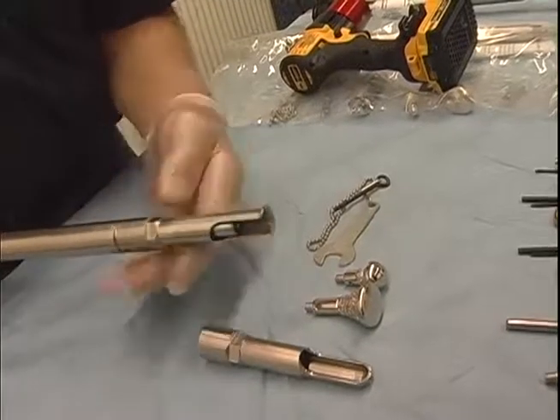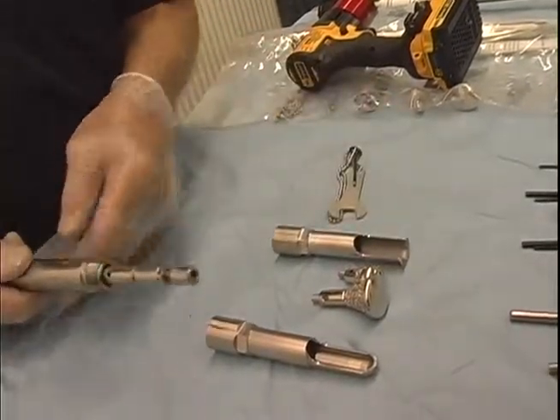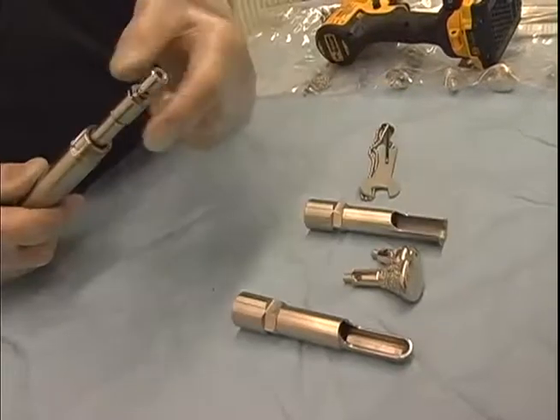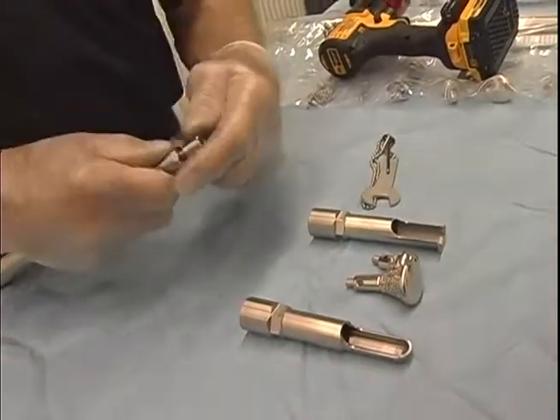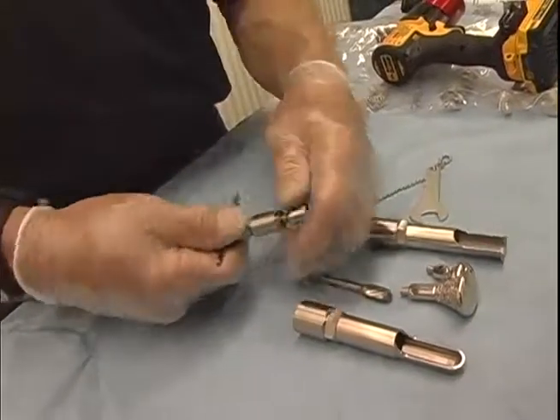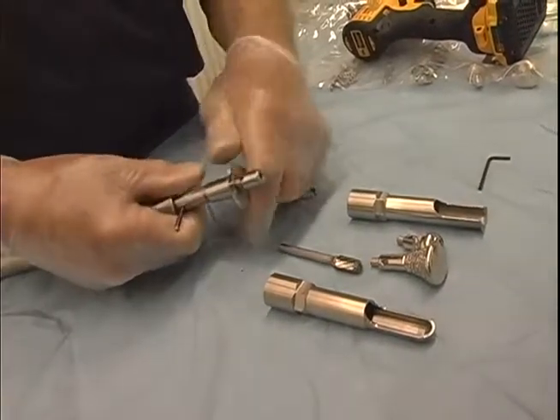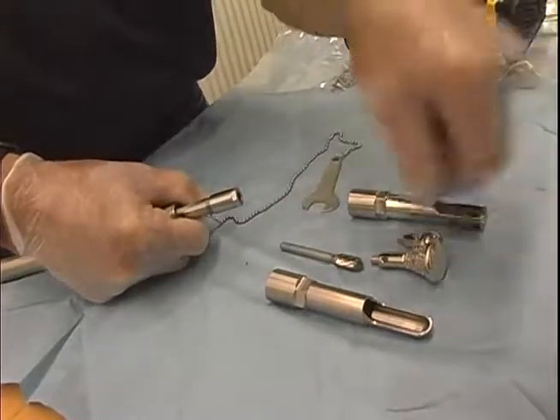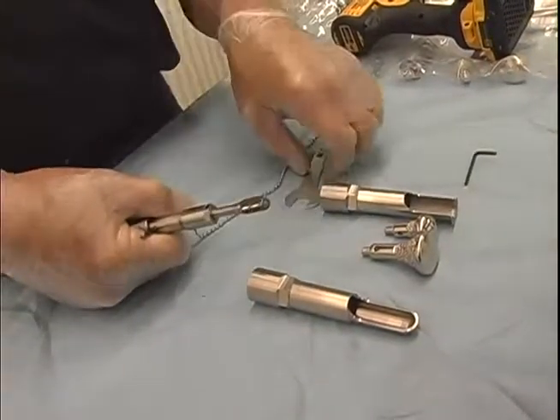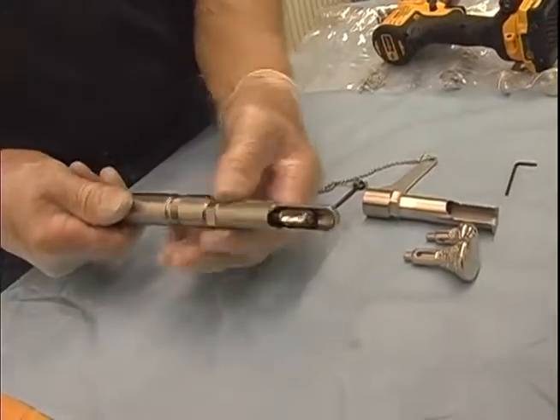Now to put this other guard on, we simply unthread this guard, and we're going to put in a small burr so that we can work on miniature horses. In this case, this burr slides into the collet, is tightened, and then this guard slides on over top.